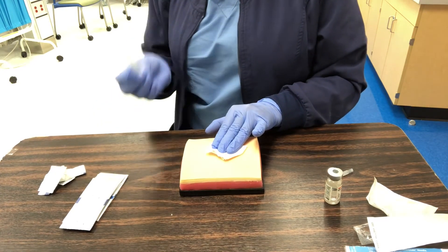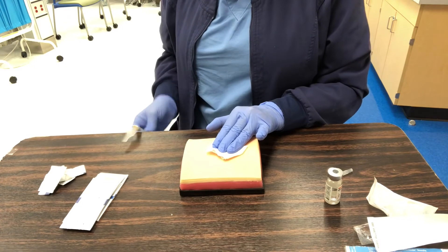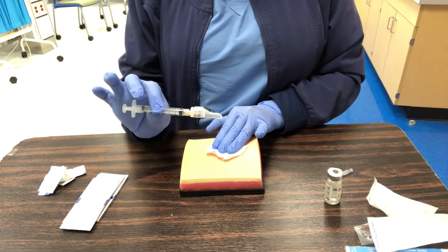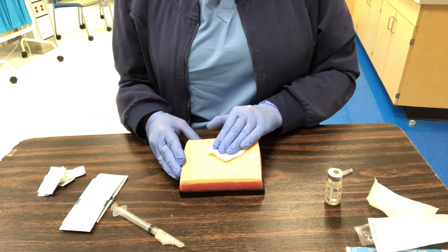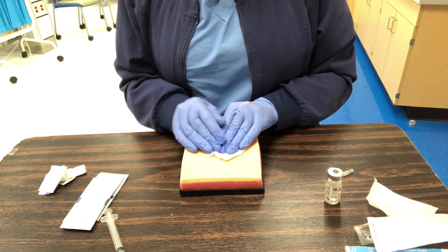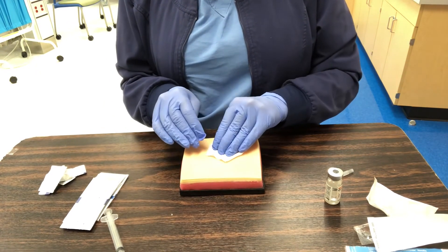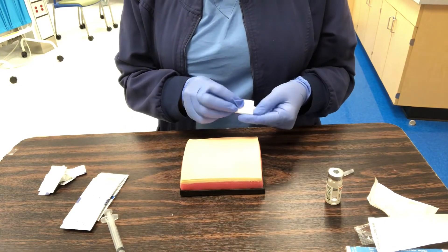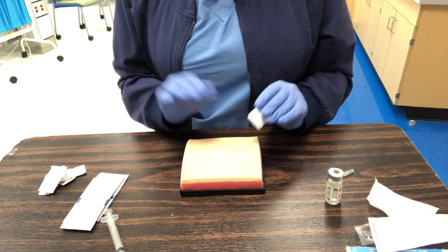I hold, and as I draw the needle back I relax that skin — the needle releases. I engage my safety by pressing it against the table or bed and lock it. The patient and I are both safe. There is no massaging for IM injections anymore — that is old school. We hold pressure until it seals, then you can apply a band-aid if the patient would like. IM injections — don't overthink it, you can do it!